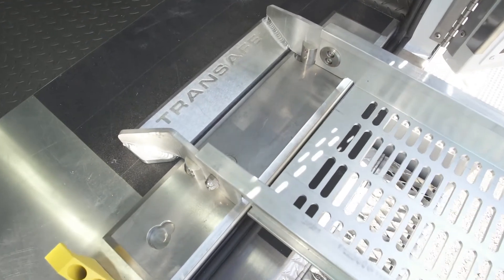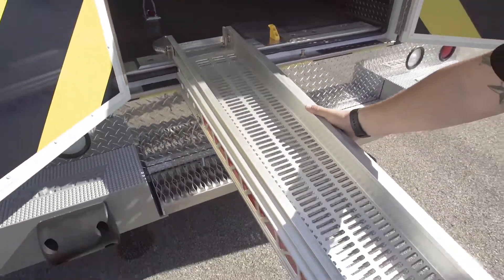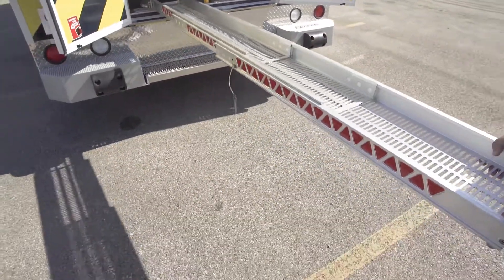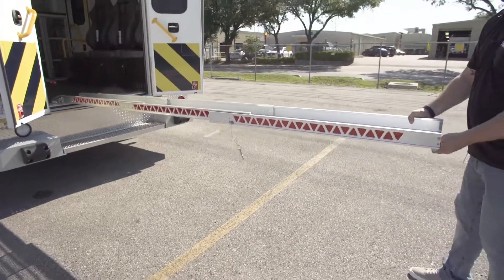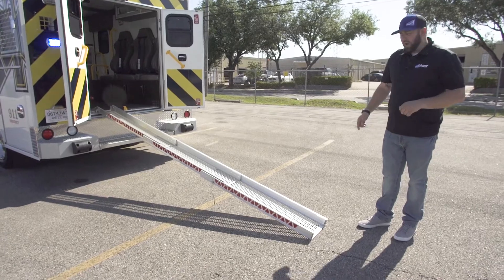Once it's locked into place, you just walk the ramps out, extend them all the way, set them on the ground, and repeat that process for the second ramp.